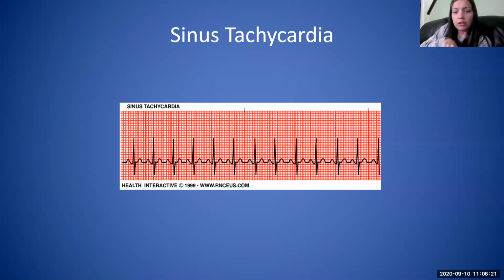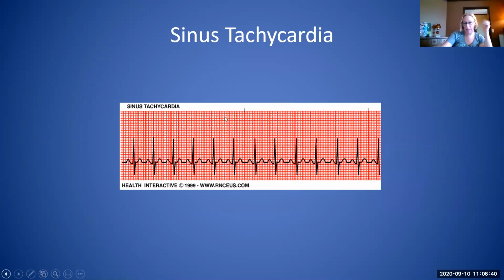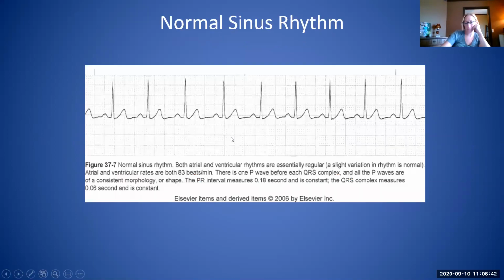Tachycardia. Yeah. So like when you're looking at that strip, the QRS, like the S dips down farther than the regular sinus rhythm. Mm-hmm. Why is that? That's normal. I mean, honestly, a QRS often does. And the other one, let me go back to the other one. Yeah, I mean, this one just doesn't happen to, but it's not abnormal to dip down further like that. Okay.